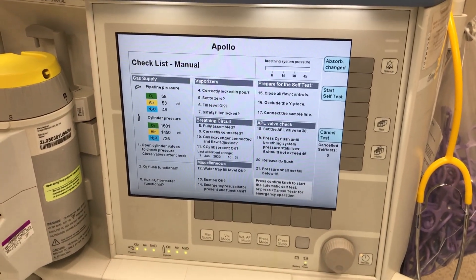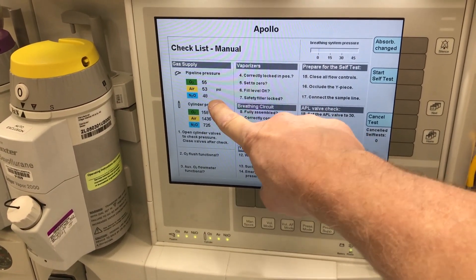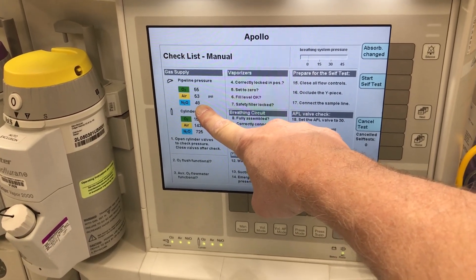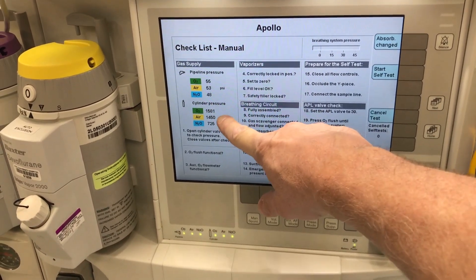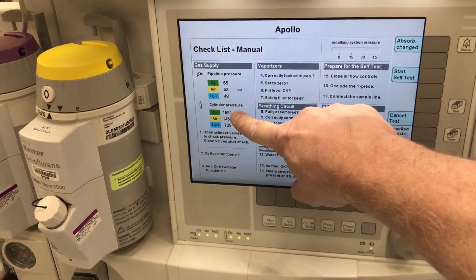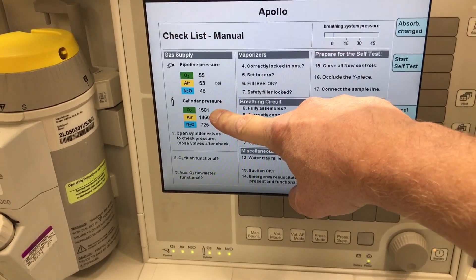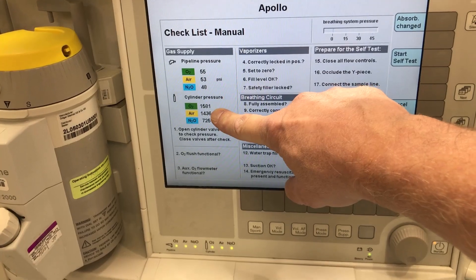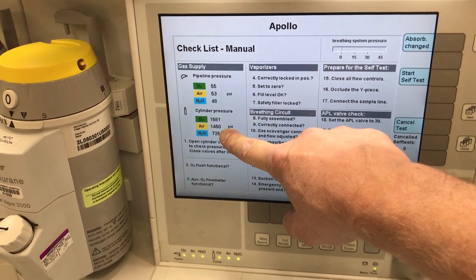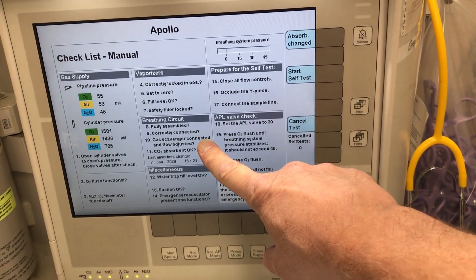When the machine is on, it has a checklist — in most of them it's just to check the pressure and the line of gases. The nitrous will be zero since we don't have nitrous lines connected in rooms outside the operating room. The machine carries three tanks; the full E-cylinder tank is about 2200 pounds per square inch. These tanks are supposed to remain closed when the machine is not using them, to prevent them emptying by mistake.